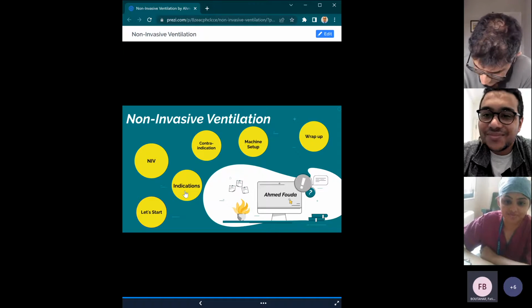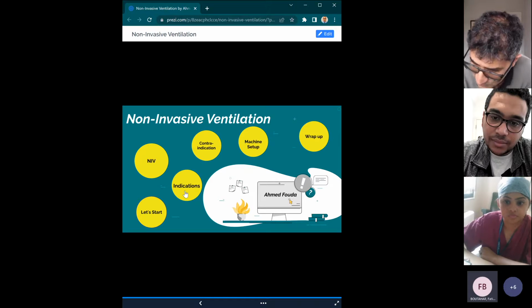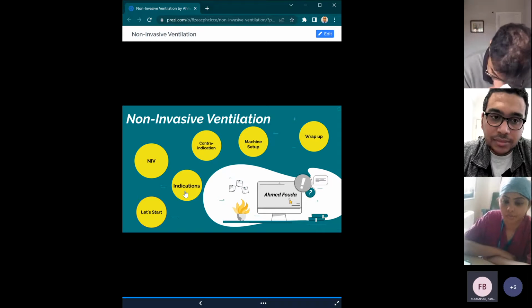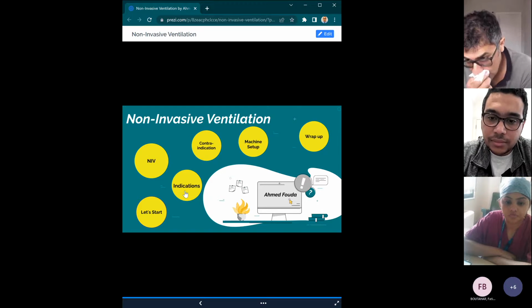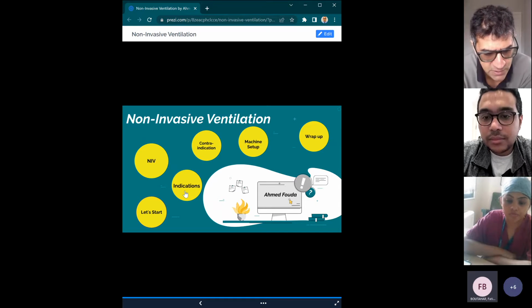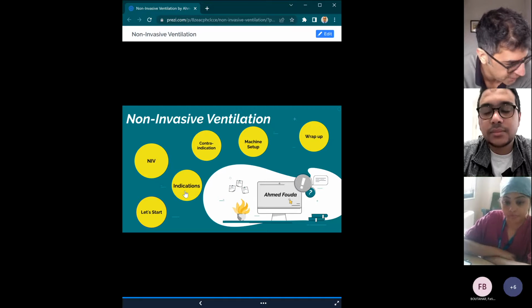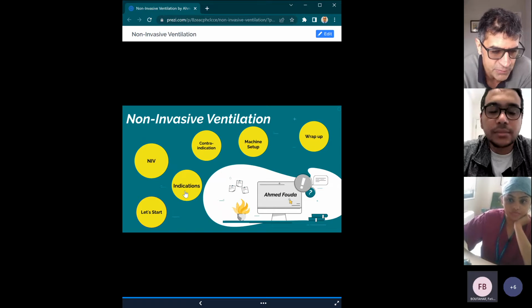So what happens basically when the patients are on NIV, especially in patients of heart failure who have pulmonary edema, many times it's very helpful, because it helps to decrease the venous return, and thereby decreases the load on the heart. Yes, that's right. So it reduces your venous return, and that's why we use it in heart failure. The first thing it'll do, people can't breathe in pulmonary edema, you apply a bit of positive pressure, and it offloads the left ventricle, doesn't it?